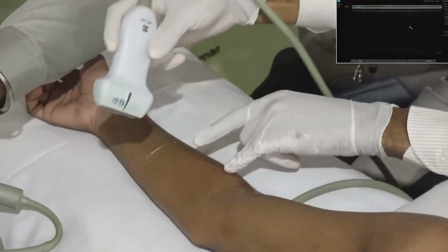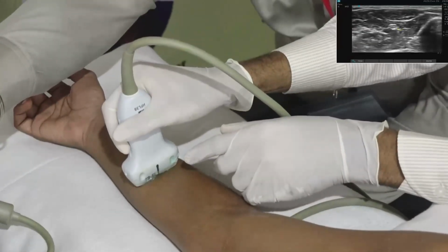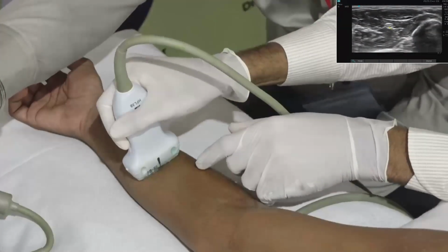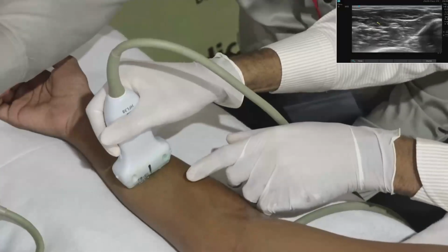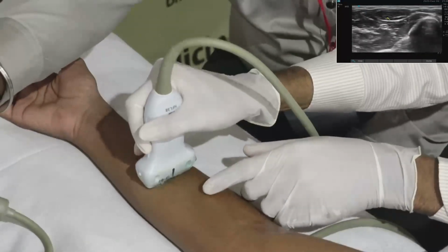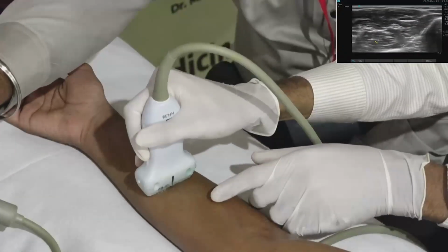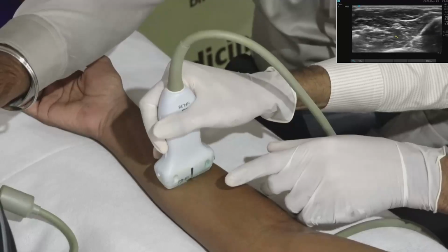The marker is away from me. The muscle above the median nerve is flexor digitorum superficialis, and the muscle below the median nerve is flexor digitorum profundus.